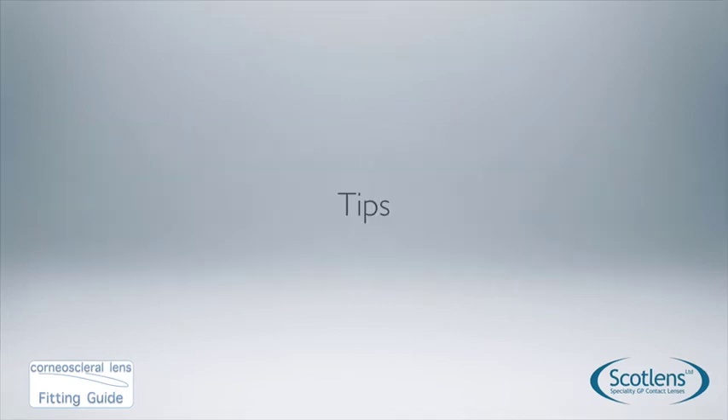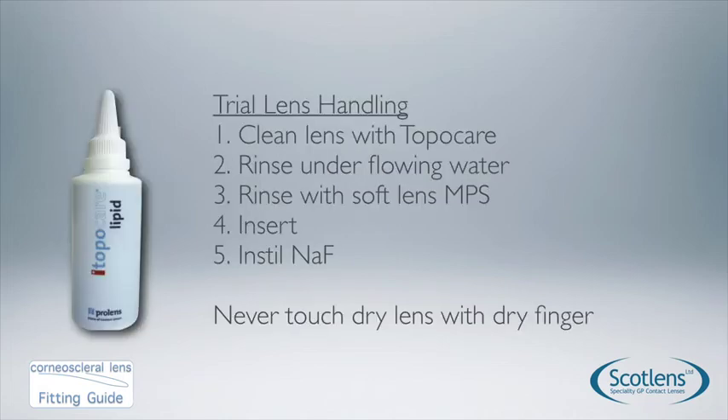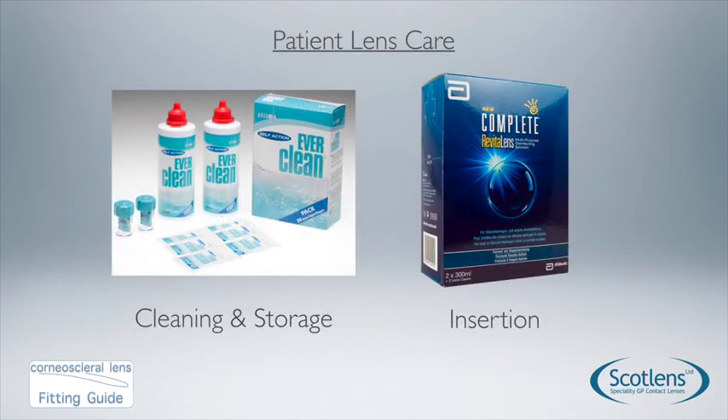Some fitting tips: trial lenses are prone to picking up grease from fingers and tear film, so clean them with Topo Care — an alcohol-based cleaner — before insertion. Thoroughly rinse the Topo Care off with water or saline as it will irritate the eye. Then coat the lens with a soft lens multi-purpose solution, insert, and instil your fluorescein. Try not to touch a dry lens with a dry finger. For patient care, use Everclean — a non-surfactant peroxide cleaning system — as surfactant cleaners can affect the surface of larger diameter gas perm lenses. Insertion is from a soft lens multi-purpose solution such as Complete.